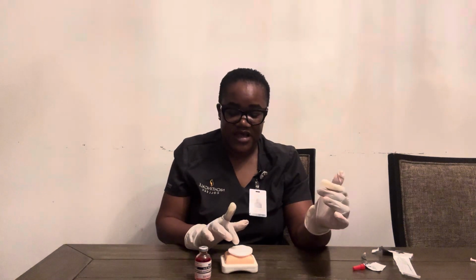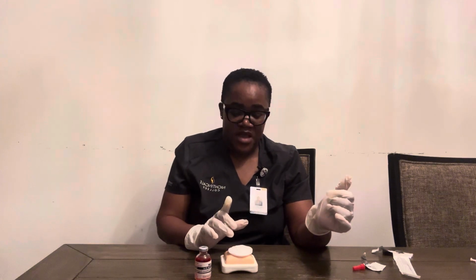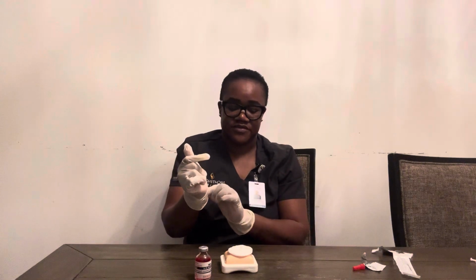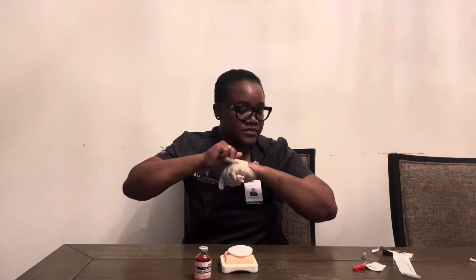Okay, so I'm not gonna rub the site after I apply the gauze. I'm not gonna rub the site. And now I could go ahead and remove my gloves. I'm gonna discard all my supplies. And then I'm gonna perform hand hygiene and go document my procedure.